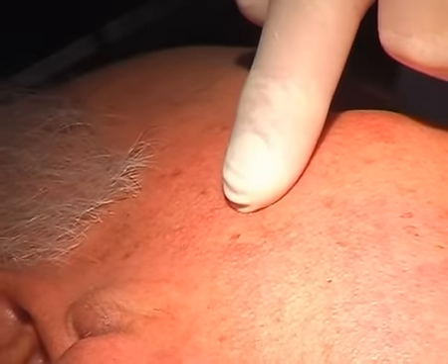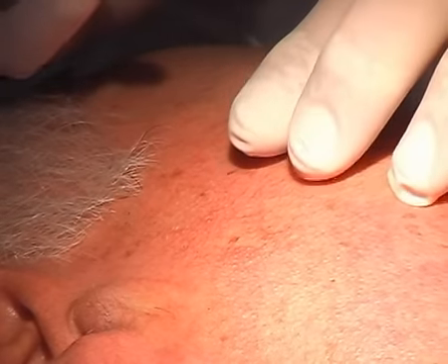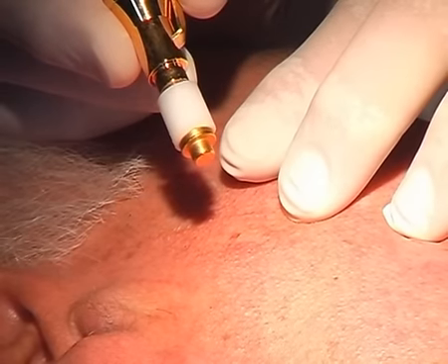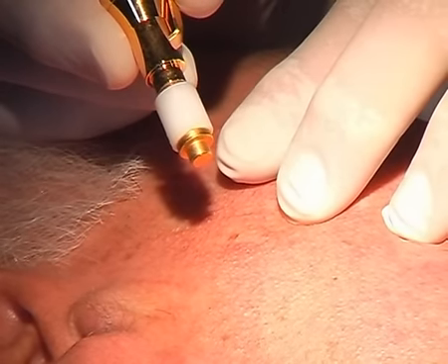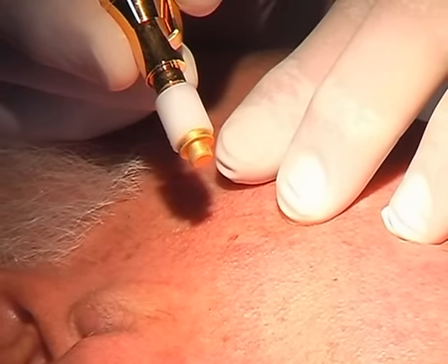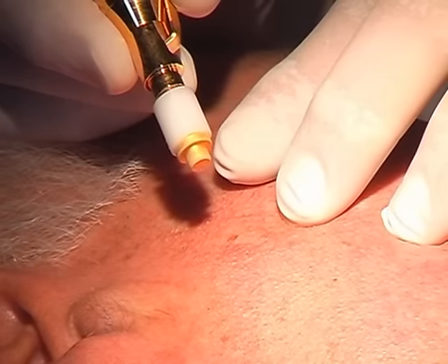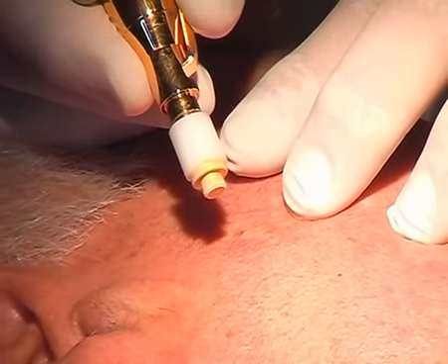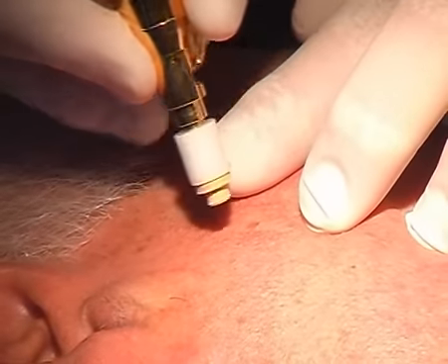Again on the same patient, we have another seborrheic wart. This time, we will remove it with the cryo-phalux perfect, equipped with a contact applicator having a diameter of 5 mm. Opposite to the liquid phase shown before, we have to cool down the applicator for 10 seconds until the front of the tip gets visibly white.